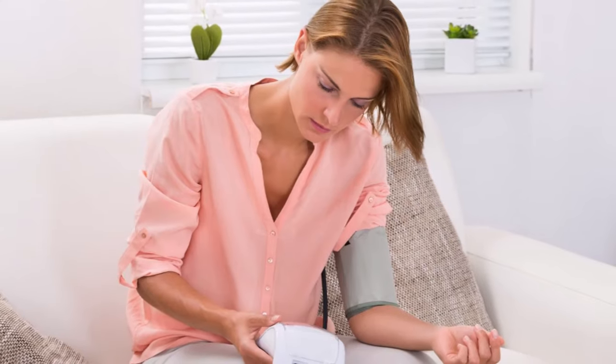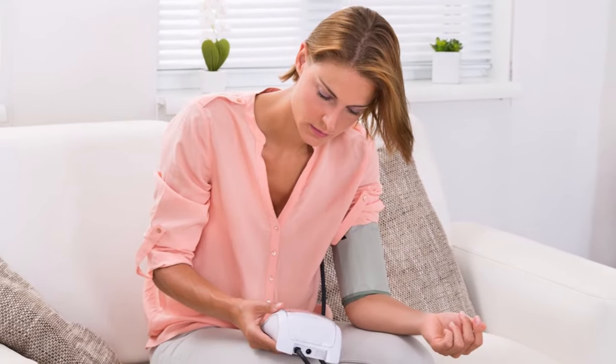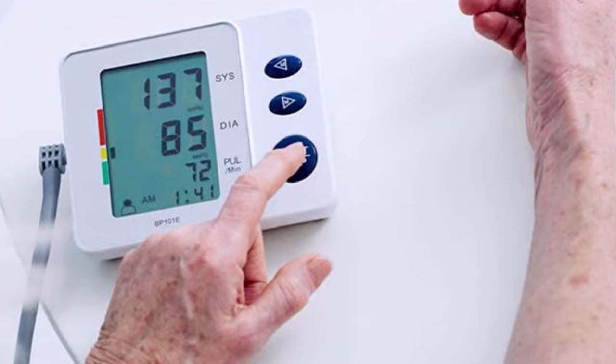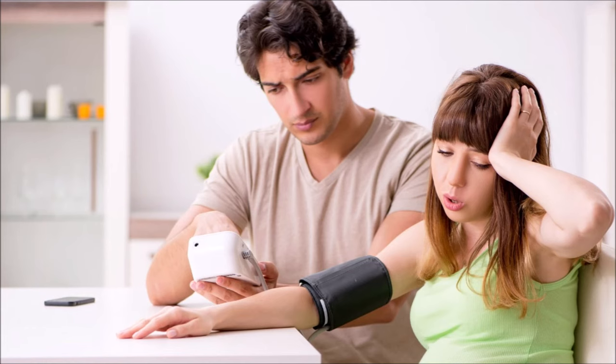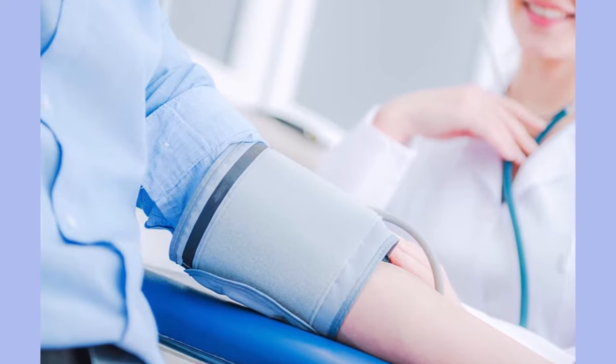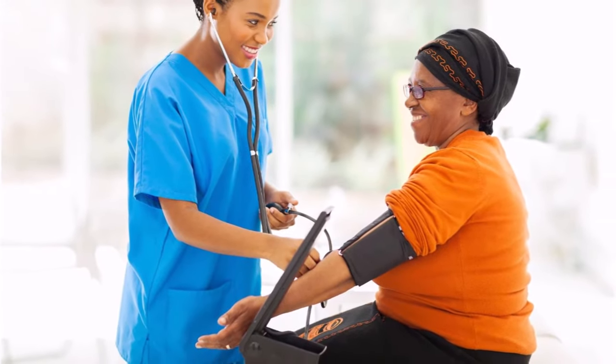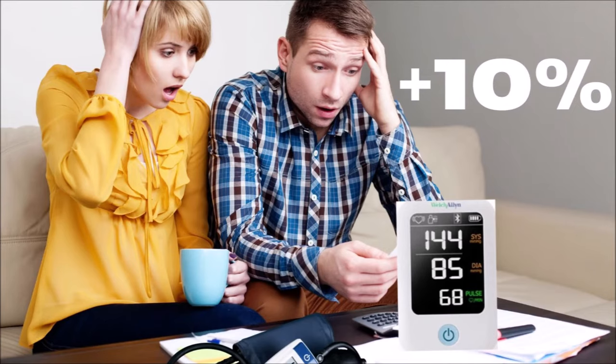For most people, taking your blood pressure at home seems easy — wrap the cuff around your arm, press the button, and wait for the reading to display. Unfortunately, there's more to it than that, and mistakes can be giving you measurements that are not typical of your daily pressure. And even if you get your arm position perfect, if you don't do one simple thing with your arm, research says it can raise your blood pressure by 10%. Keep watching and I'll tell you about that one thing also.